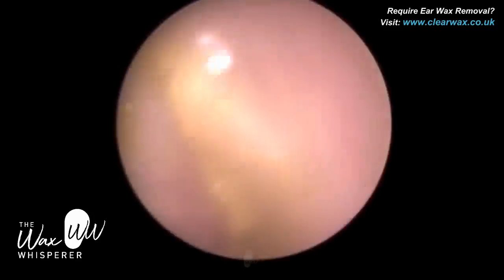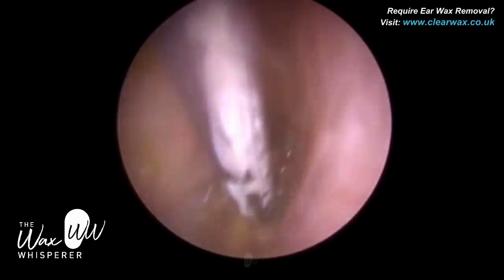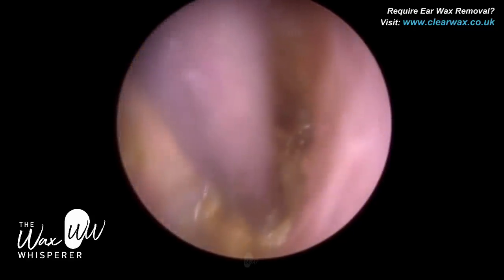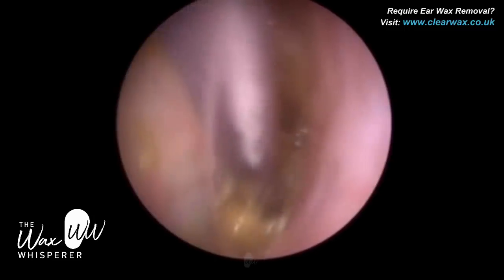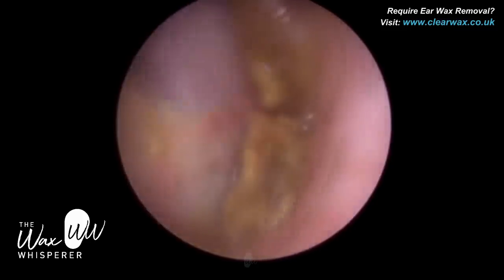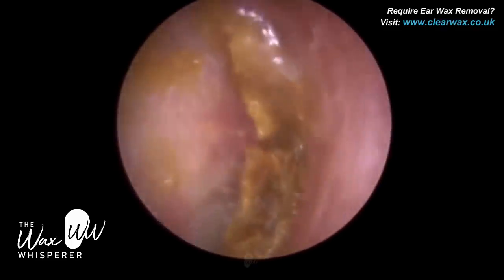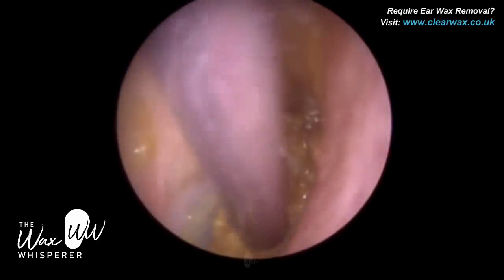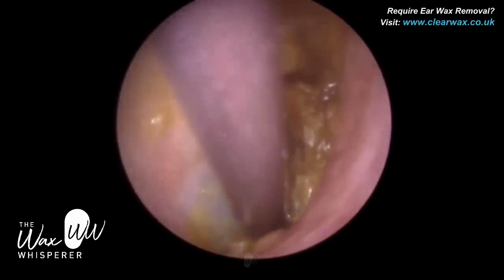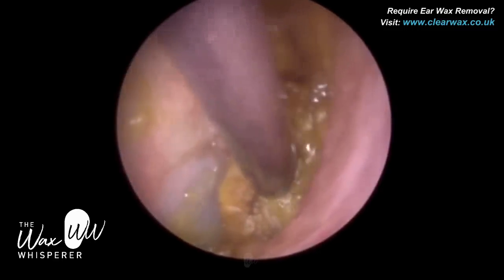There's a remaining plug of wax directly on the eardrum, and it's actually lodged in the anterior recess. The ear canal, probably about half a centimetre away from the eardrum, has a narrowing, and then the ear canal protrudes back outwards — that creates two distinct recesses: the anterior recess to the front part of the ear canal, and an inferior recess. This creates almost a crater at the base of the ear canal. Quite often you get wax lodged in both the inferior recess and the anterior recess, and it can be quite tricky to remove, especially when the wax is soft and mushy like in this patient.